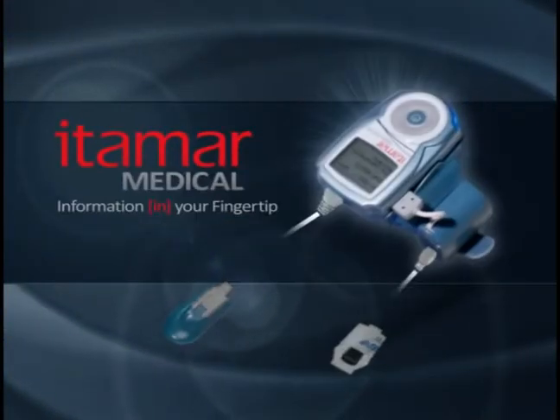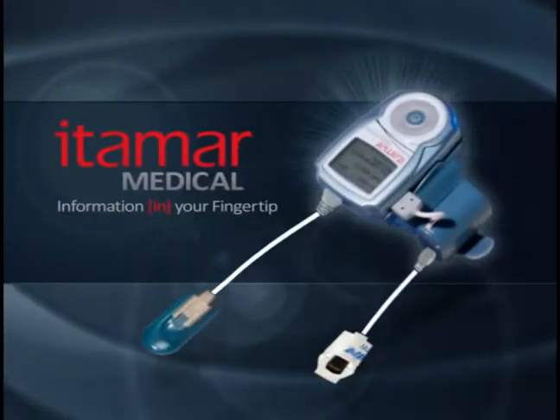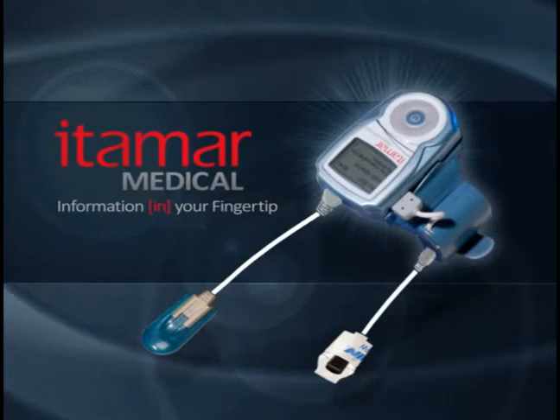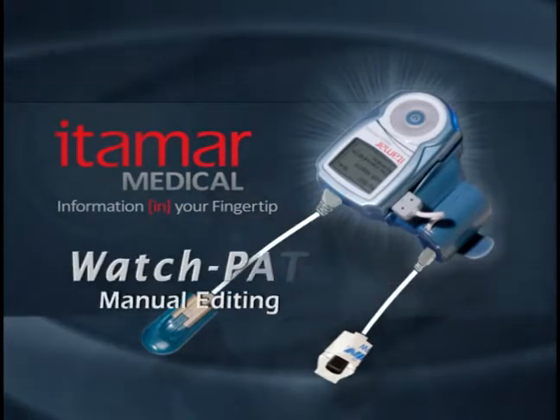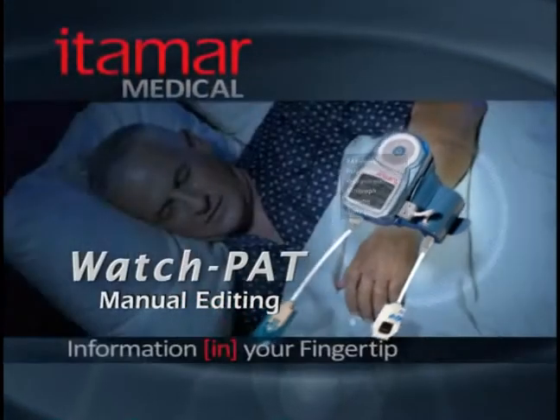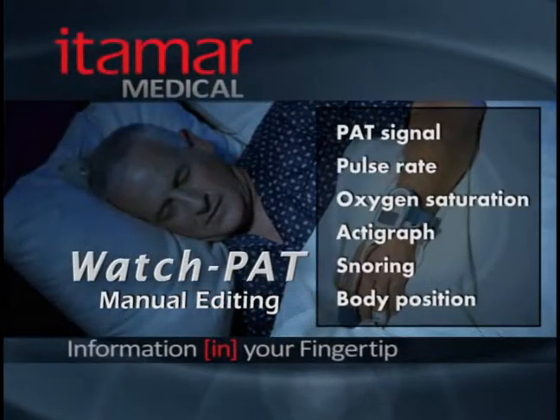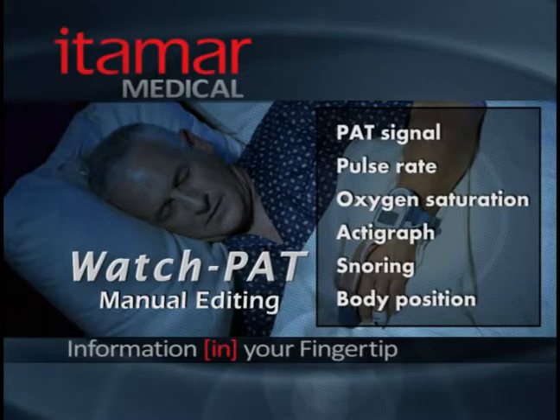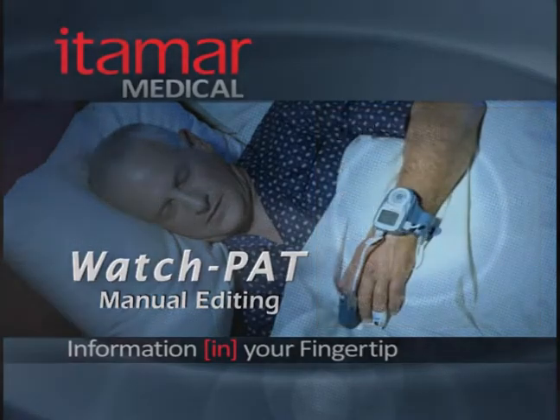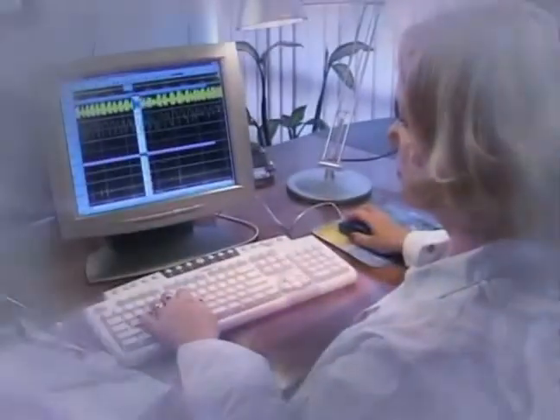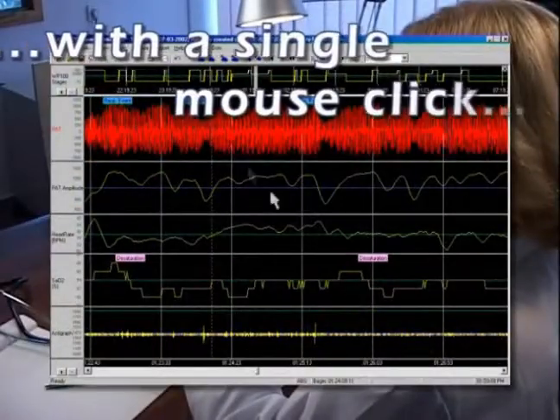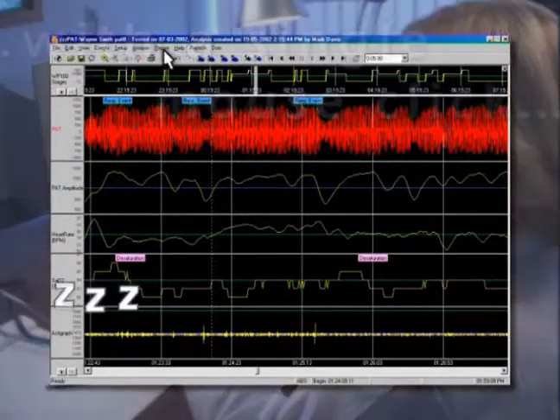Manual editing of automatic scoring using WatchPad is easy. WatchPad provides six channels of data for review by the sleep specialist. The software's manual rescoring process is intuitive and easy.